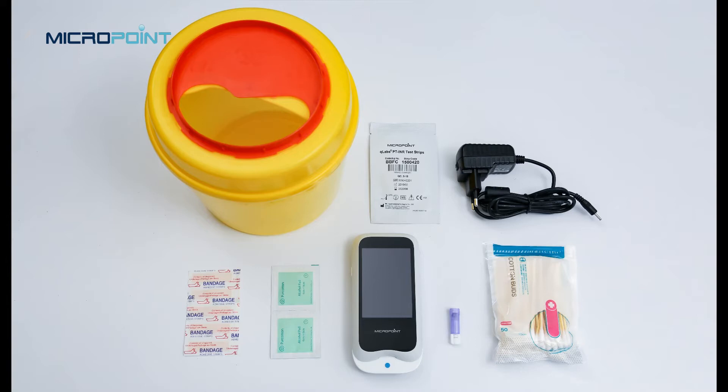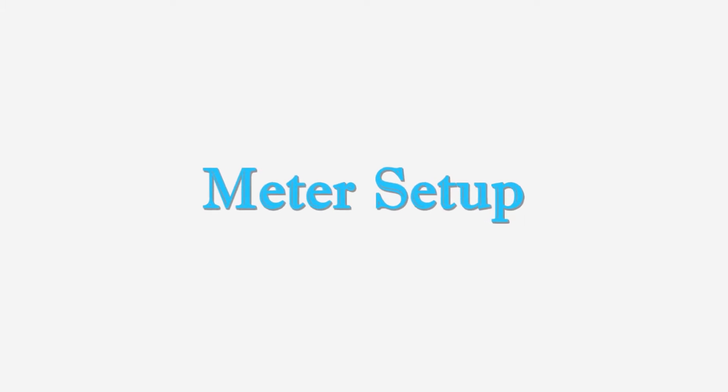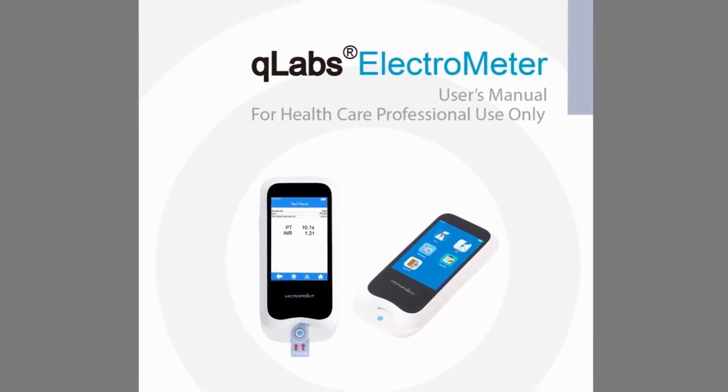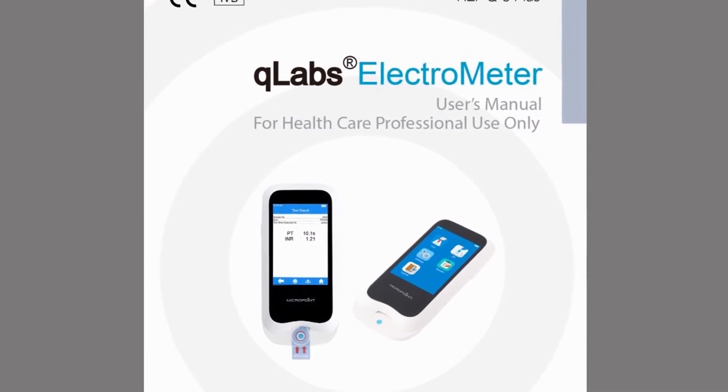Before using the Q-Labs monitoring system to do a test, you will need Q-Labs PT-INR test strips, a power supply, a puncture-proof container for disposing of sharps or biohazardous materials, alcohol wipes, gauze, a band-aid, and a lancet device.